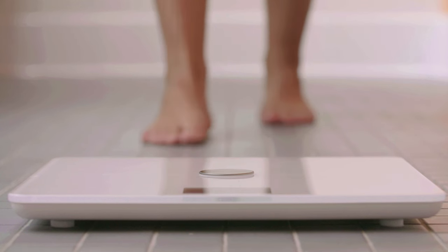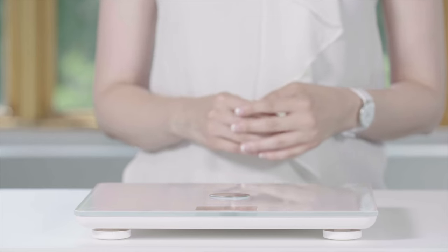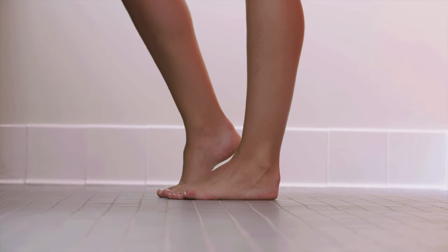Once your scale is in a good spot, be sure to wait 10 seconds before you step on the scale. For the scale to take body composition measurements, you'll need to have bare feet — no shoes or socks on.